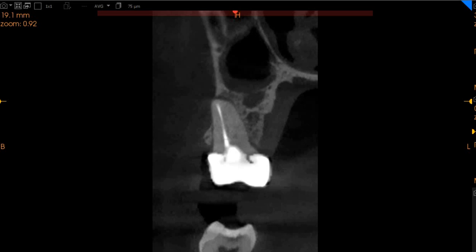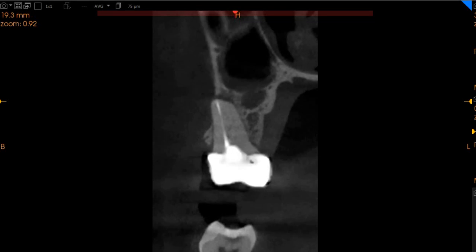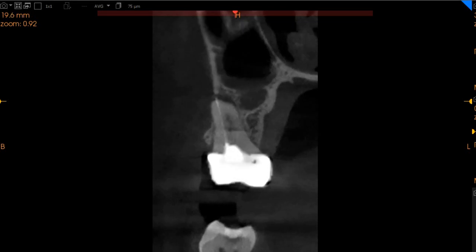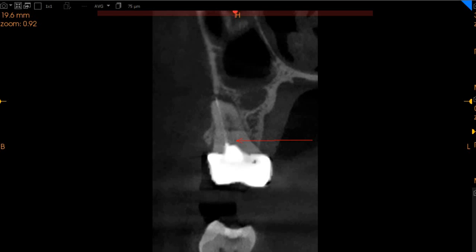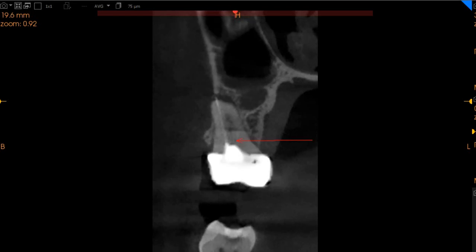The MB1 canal has been obturated whereas the MB2 canal has not been obturated. We can see that there is a presence of an MB2 right here — we've marked it on the other views as well. This is where the entrance of the MB2 is, and we've got a radiolucency here as well.